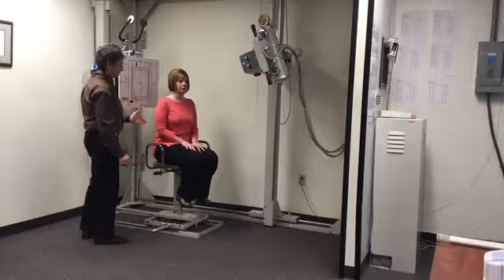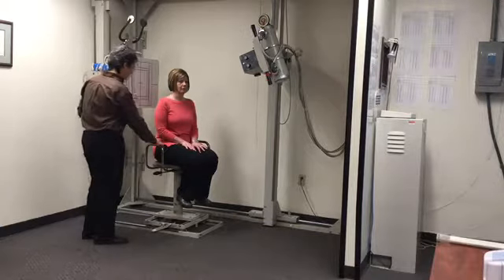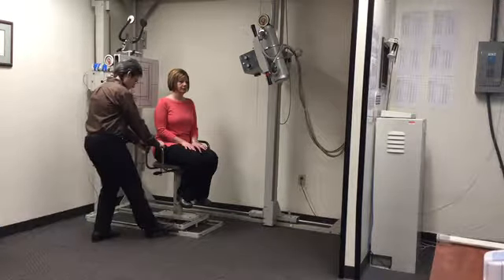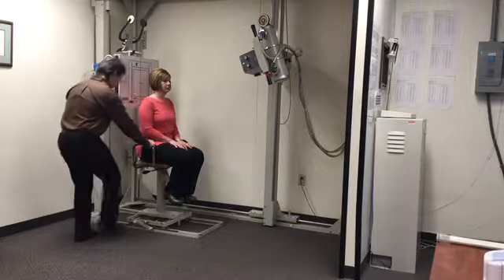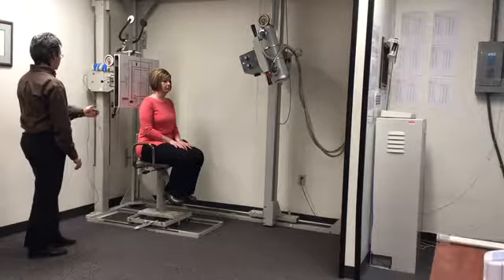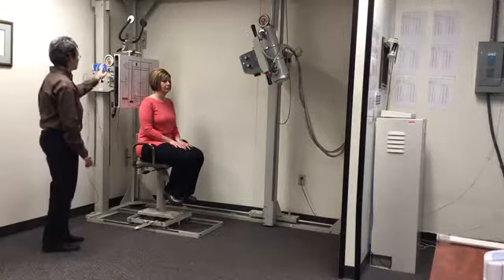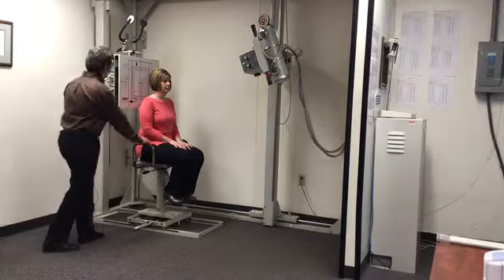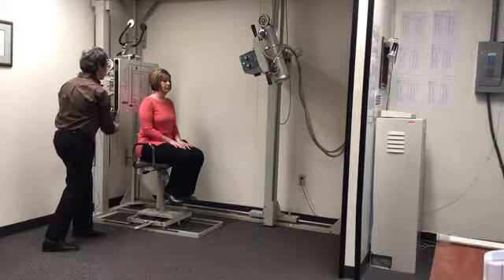No normal head carriage for our specialty images. Just make sure the patient's face is pointing in the direction that's required for the image. Next, bucky to patient. For this image, we're going to have no head-shoulder angle, so the bucky needs to be 90 degrees perpendicular to the floor, and it is, so the white needle should hang on 90. We're going to rough in the height of the bucky so that the 10 by 12 field is right around the back of her head and neck area.